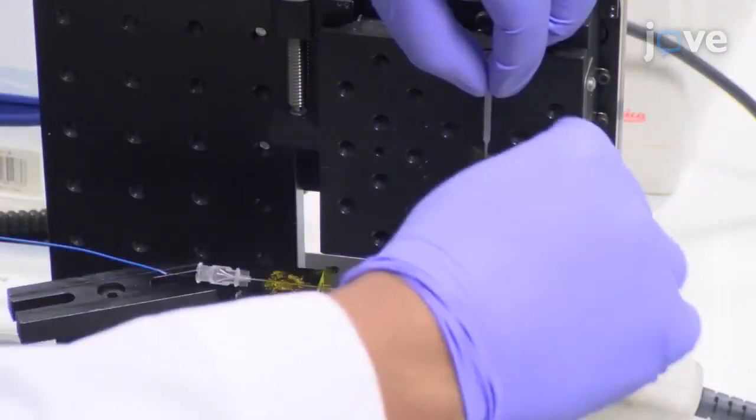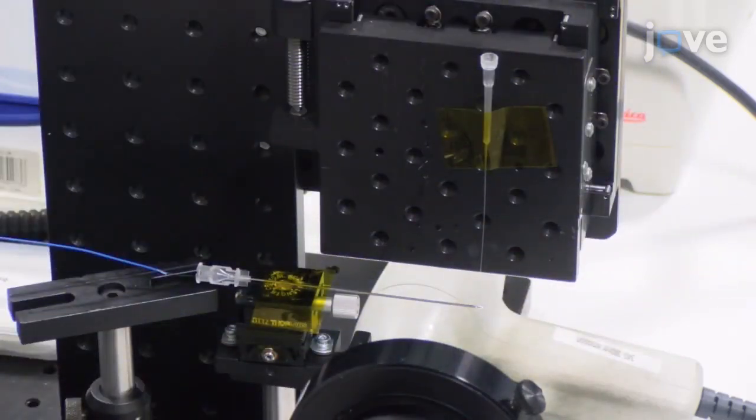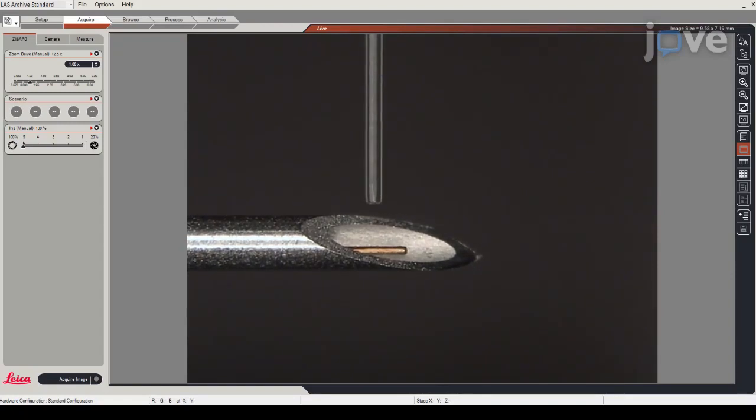Vertically affix a 20 microliter pipette to the vertical translation stage with the tip facing downward, and use both the horizontal and vertical translation stages to position the micropipette tip until it is adjacent to the fiber optic hydrophone at about 0.5 millimeters.